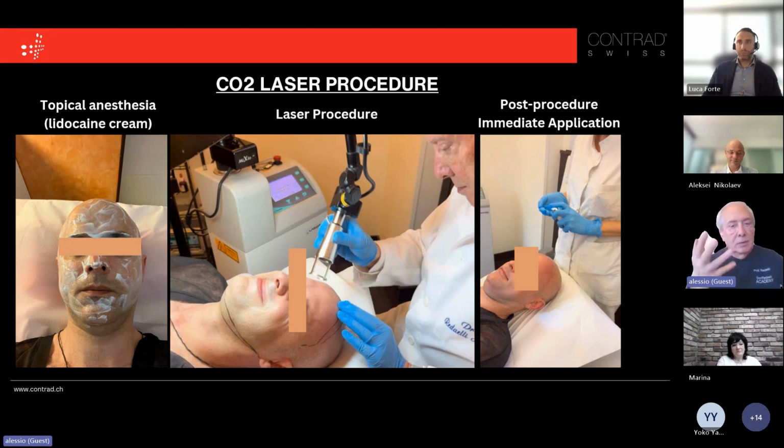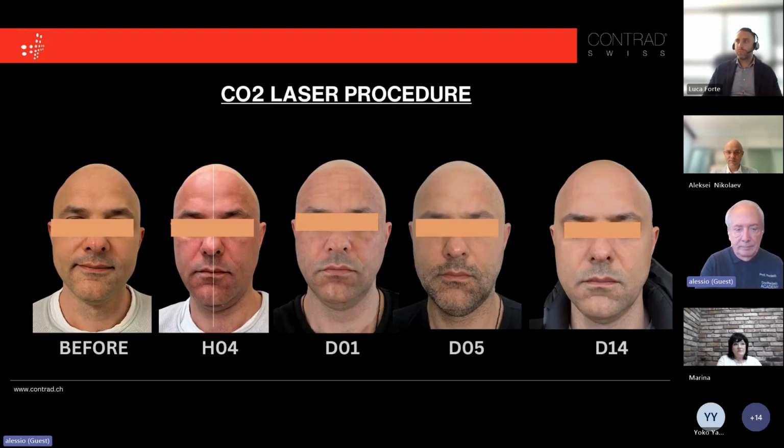The skin is totally burned, and so there is some smoke arriving from the procedure. With the lidocaine cream, this is not only lidocaine, but it's lidocaine and prilocaine cream, the pain, honestly, is reduced in a very good way.